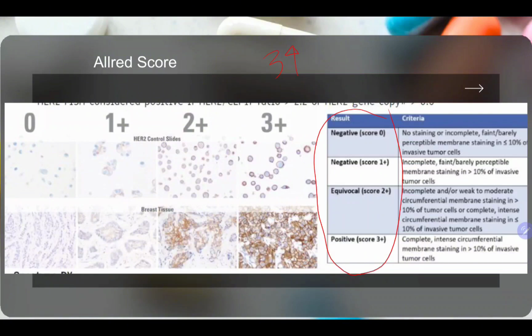Okay? Another thing po na mas delikado, if walang nag-positive sa tatlo, if nagpa-test ka for ER/PR, HER2/neu, then negative sila, nagka-triple negative sila, mas delikado po yun. You will not know what kind of treatment ang ibibigay sa patient. Okay? So, dito sabi, negative pa din, no, for HER2/neu kahit na merong score na 1+. Okay? Yun, negative po siya. Tapos, positive po siya pag 3+. Okay? Positive siya for HER2/neu kapag 3+.